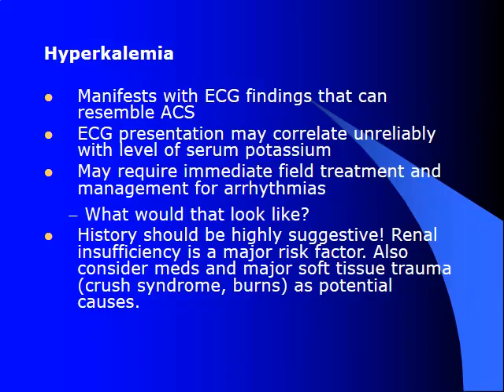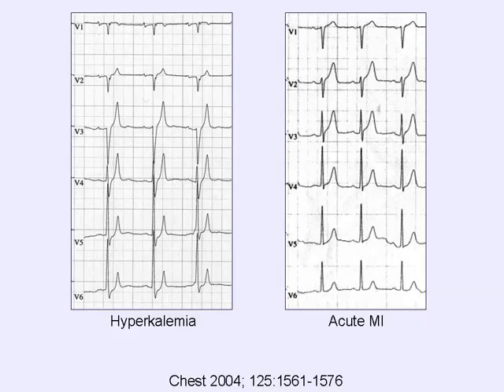All right, we're going to talk about hyperkalemia. So here we have an example of our changes that we'll see in hyperkalemia, looking at our left, and then what we have in our typical anterior MI setting on the right. So on the left side, note that we do have some ST elevation. The biggest thing that we want to remember is that we need to look at our T waves.